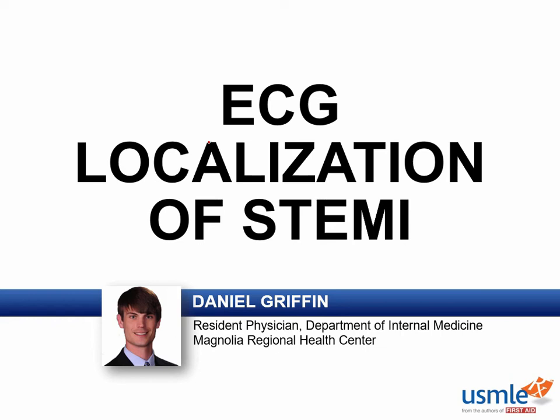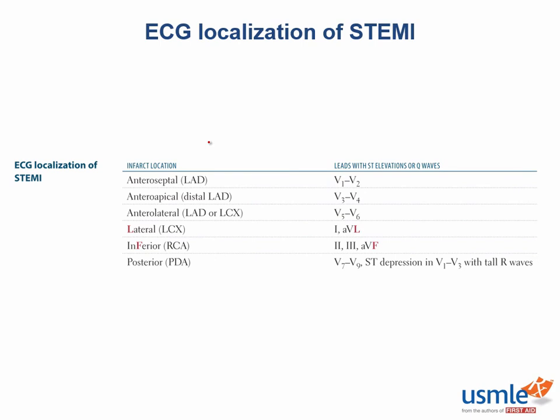Alright, now we're going to talk about ECG localization during a STEMI. Now, this is a table that's from your book, and it would serve you well to commit it to memory. While it actually may not be all that hard to memorize this one table, let's talk about the concepts of ECG localization and why we see what we do see on an ECG during a STEMI.